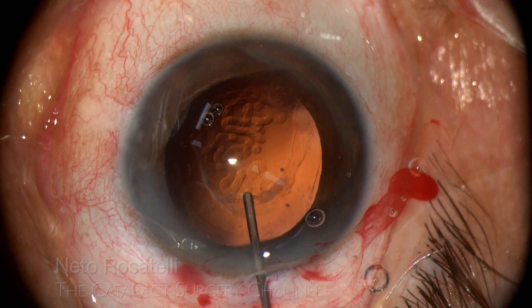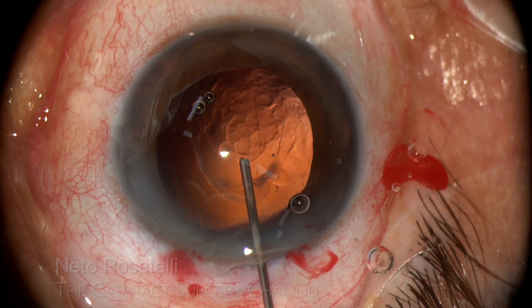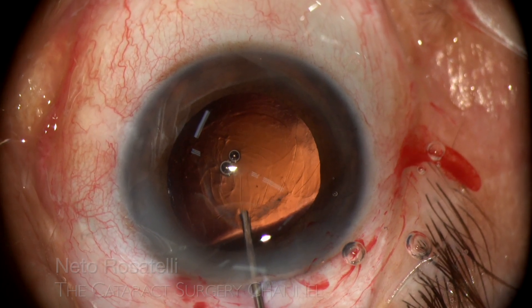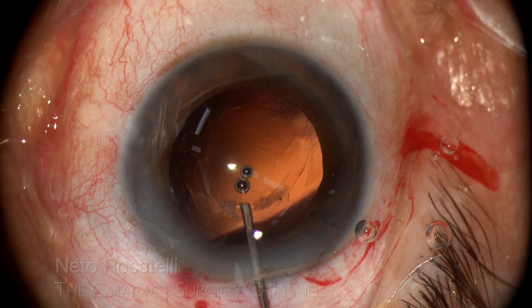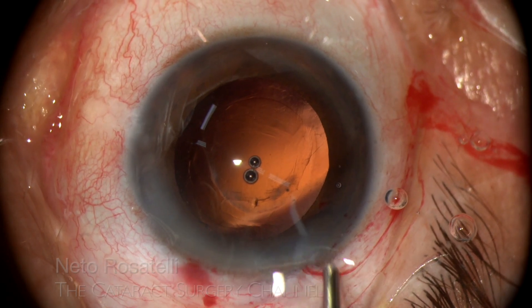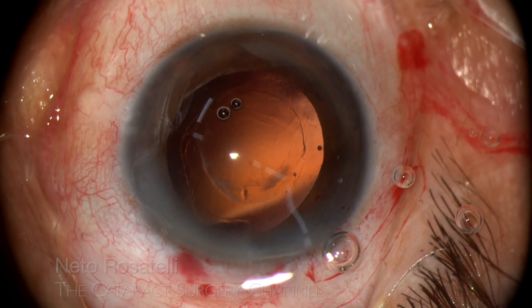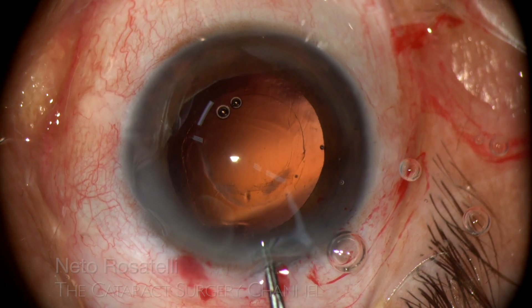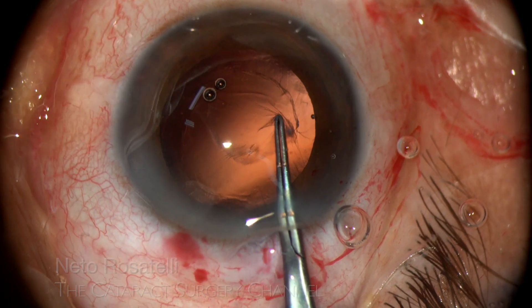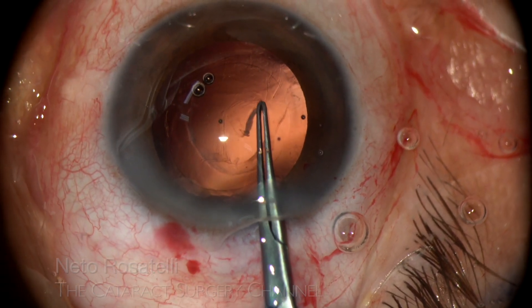I then inject OVD in Berger's space with a thin cannula and make a cushion underneath the capsule encompassing the area of the intended rhexis. I use the anterior rhexis margin as my guide. I use the other side and try to make the opening a little smaller, going spiraling out until the desired diameter is reached.